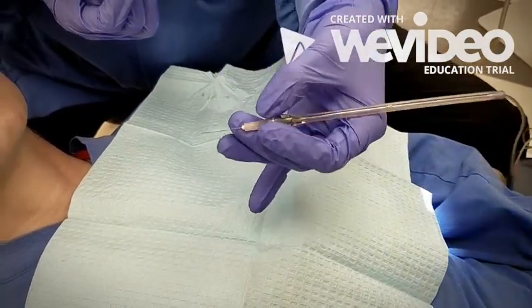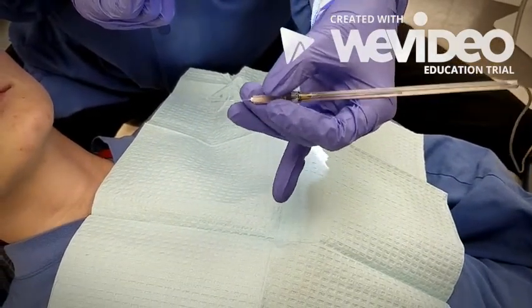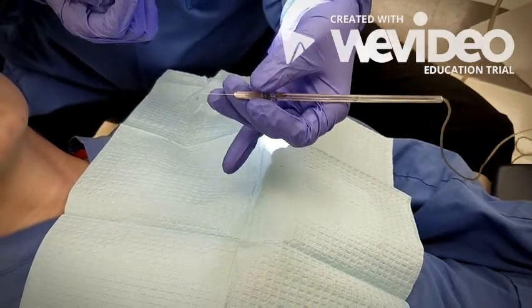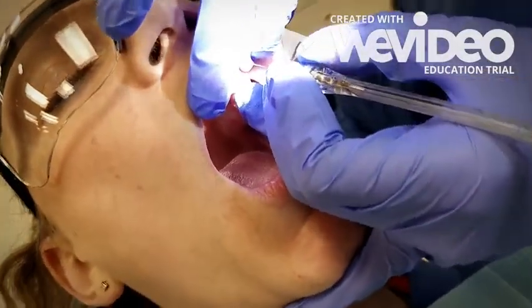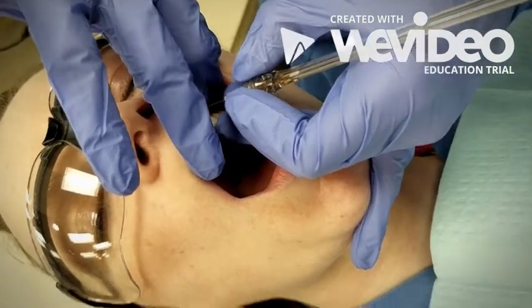The control of the wand is transferred to the small muscles of the fingers and thumb, leading to more precise needle control and dexterity, and tactile sense is enhanced. The handpiece itself only weighs a few grams, making it much less fatiguing. And the wand is held within 2 inches of the insertion point. This is compared to the rather far distance of 9 inches that you would expect with a traditional syringe.